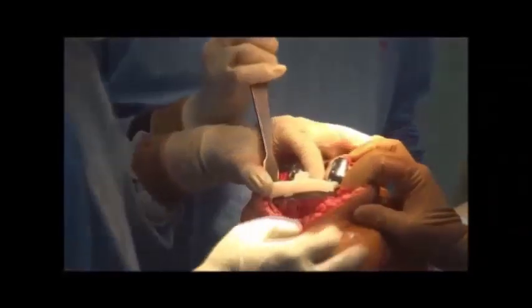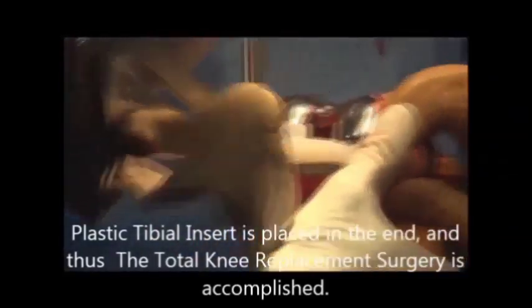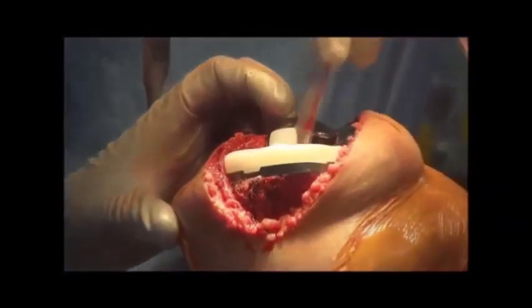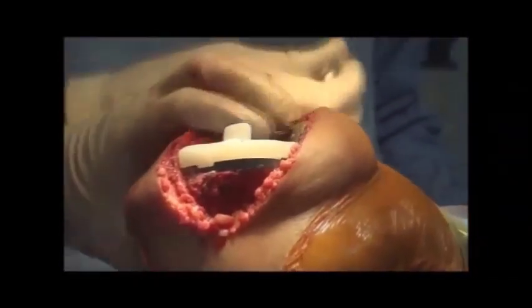In the end, the plastic insert is locked into the tibial component. This plastic insert is an inert material which works as a spacer between the two metallic components and separates them. This way, it reduces the friction during the movement of the knee joint and also avoids the deposition of metallic debris, which otherwise would happen in the absence of this spacer.